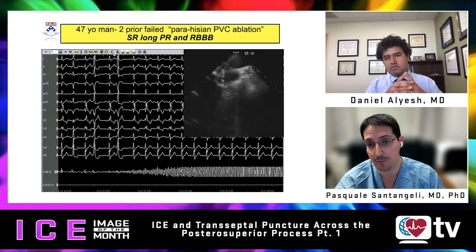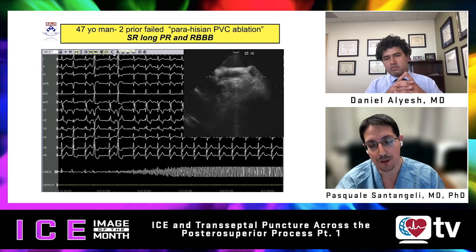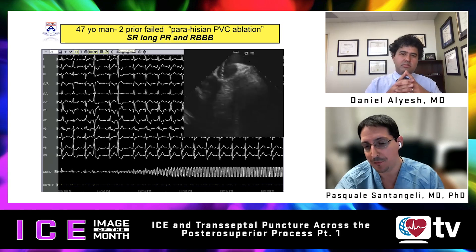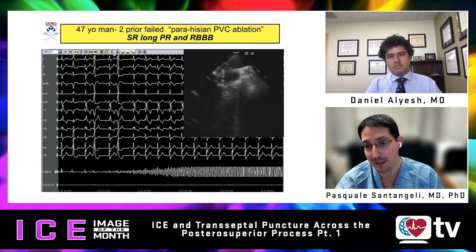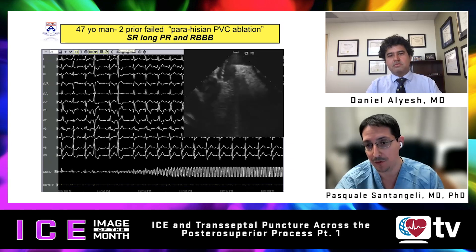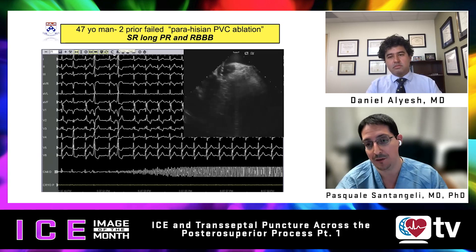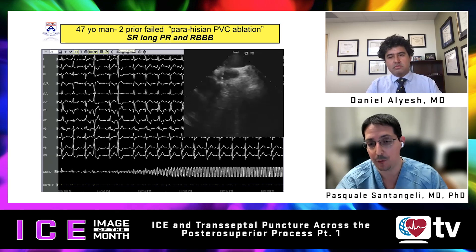This case was performed with cryoablation, as seen by the artifact. The case had previously been attempted thinking it was a para-Hisian PVC and was ablated on the right ventricular side, causing transient PVC suppression that wasn't durable and also injuring the right bundle branch. The PVC was actually more septal — in the posterior superior process — and was targeted from the right atrium using cryo early on.